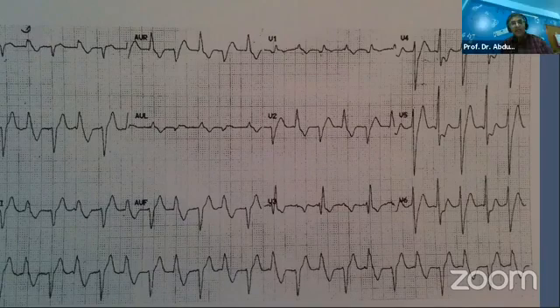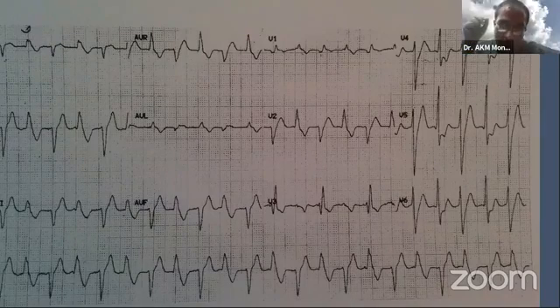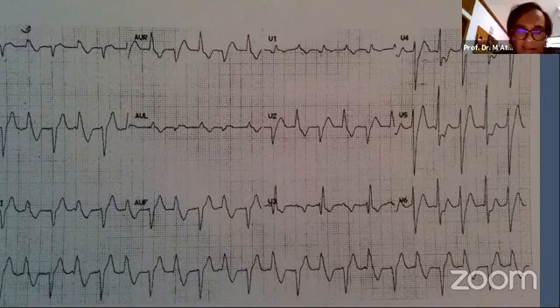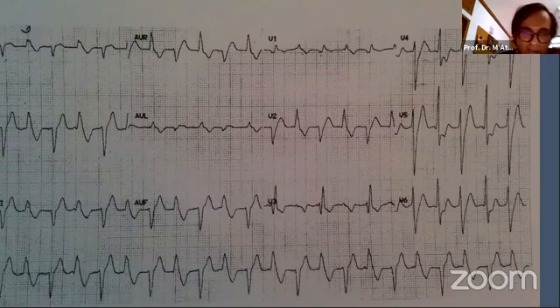Want to add anything? Yes. Manohar, বলছিল কিছু? Sir, in case of bigemini, the matter of compensatory pause cannot be justified. Yeah. Right, exactly. Because it's a very recurring thing. Manohar, thank you very much. তুমি কিন্তু মানে you correctly diagnosed before our discussion. So এটা দেখতে ক্লাম যে ECG ছিল আমাদের মেসেজটা কিন্তু I think that's the last one.